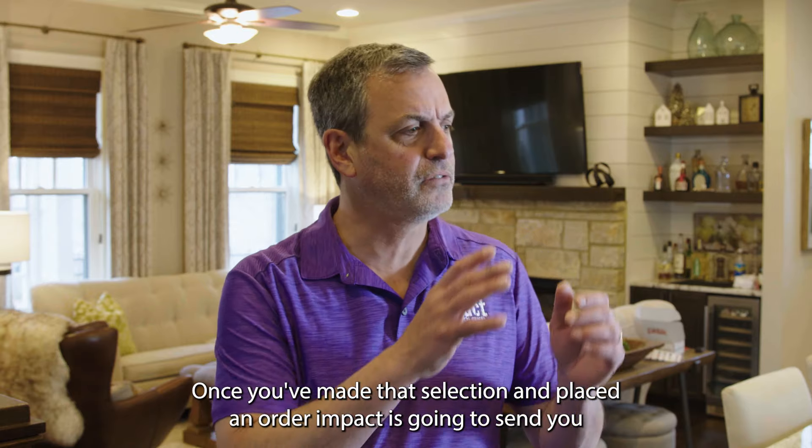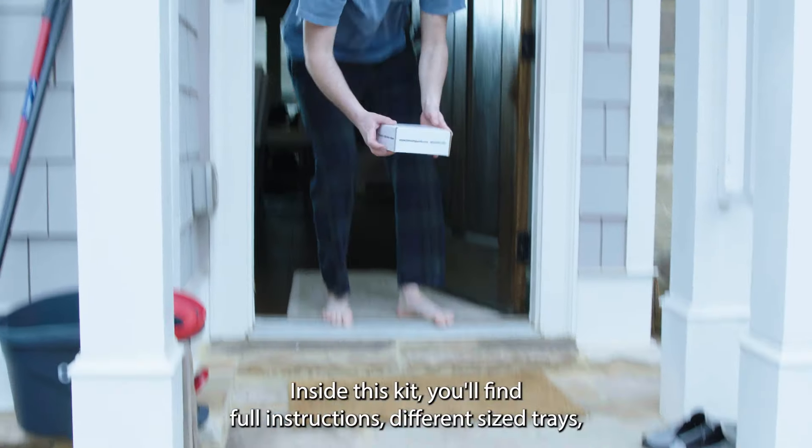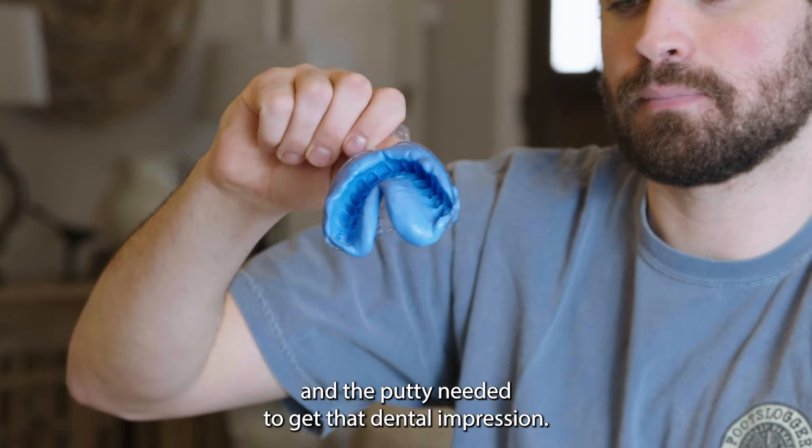Once you've made that selection and placed an order, Impact is going to send you our super simple fit kit. Inside this kit you'll find full instructions, different sized trays, and the putty needed to get that dental impression.